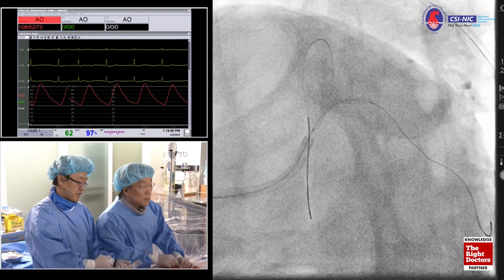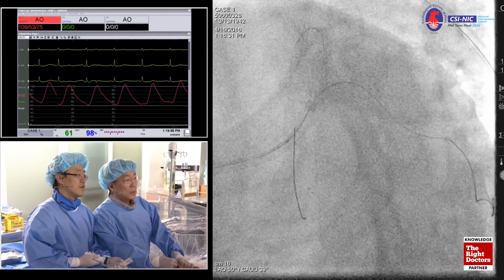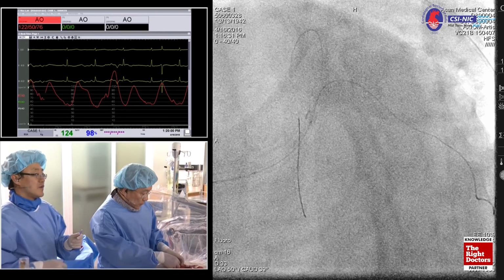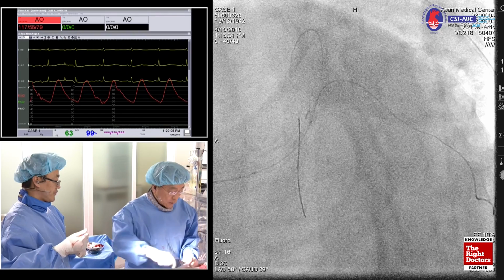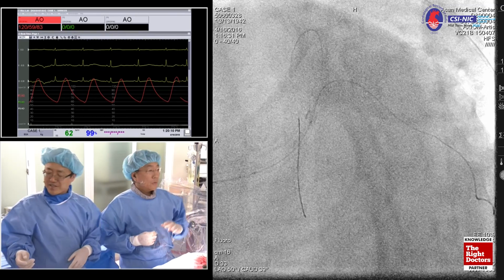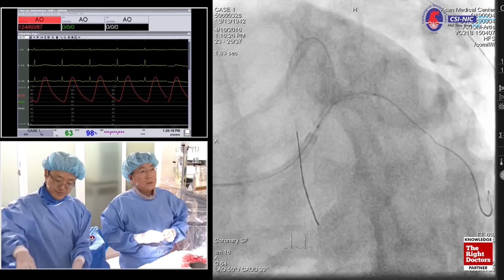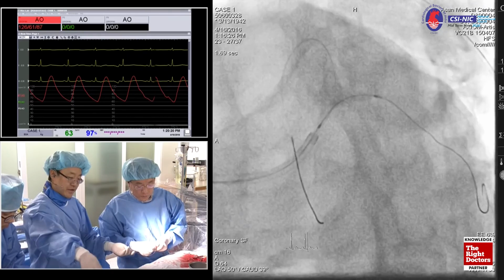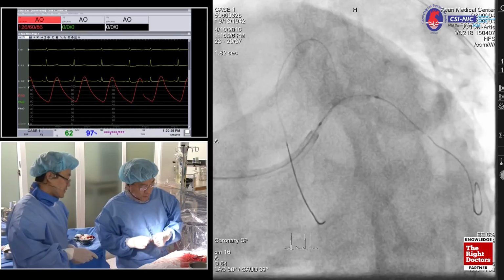Is there any other indentation? No, no indentation. So I believe it's quite easy to pass the stent for this one. Okay. 15, yeah, 3.0. We want to choose a 3.0 based on the IVUS findings. There are big ones. So 3.0, Giants Alpine, and length 15, right? 15 length.